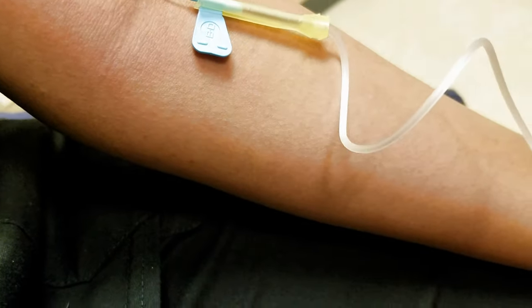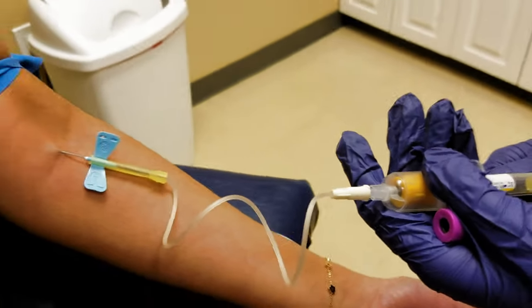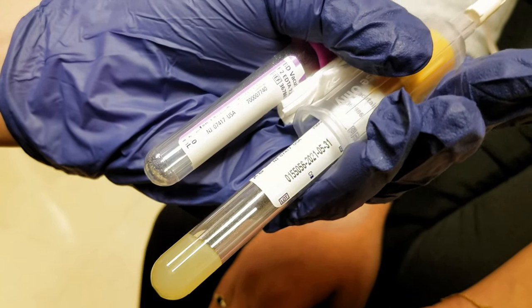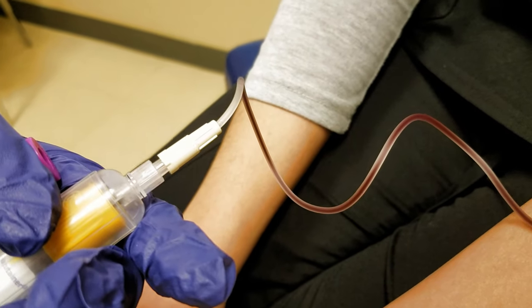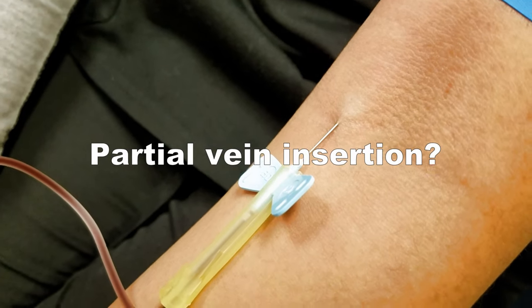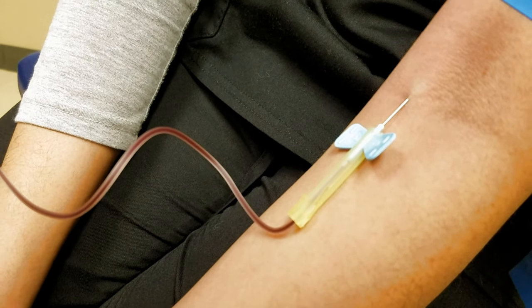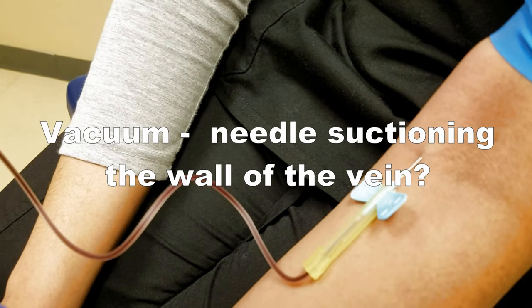Go ahead and push. This is actually good — right now what we have is a problem. She's put the needle in and blood is going very, very slow. One possibility is she's not in the vein all the way. One thing to do is to either push in or pull back about a millimeter, whichever way you think it needs to go. The other thing that can happen is the needle can stick to the wall of the vessel.